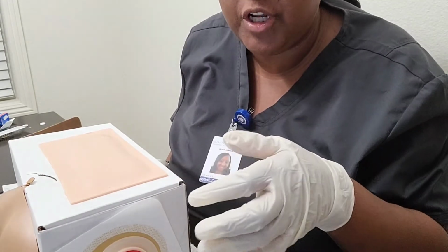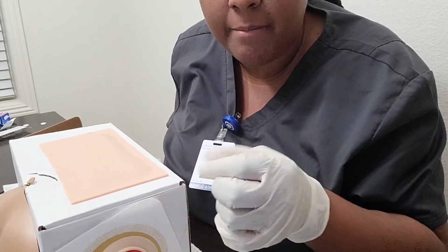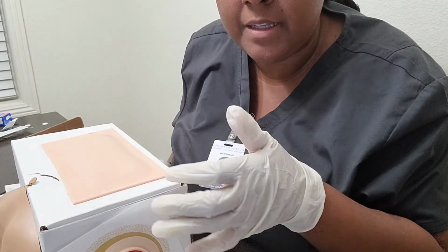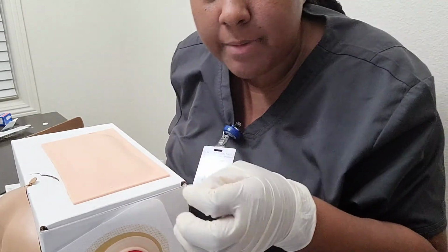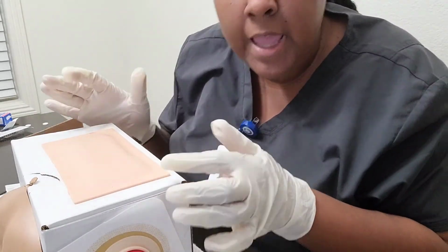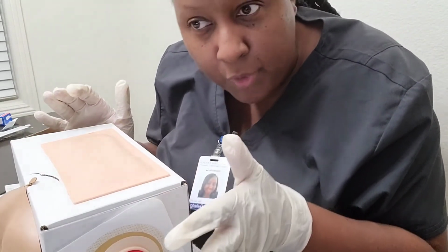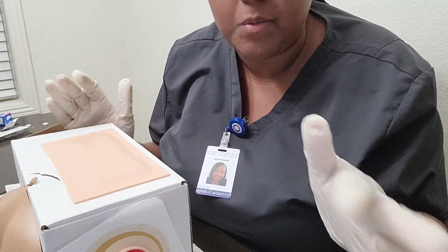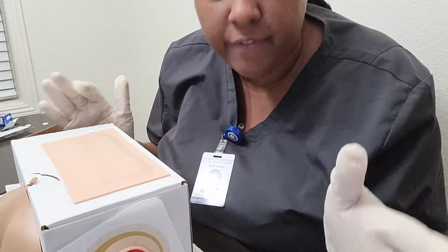And I would just like to note that I will measure the correct size by grasping the skin fold at the site with my thumb and forefinger, and measure the fold from top to bottom to make sure that the needle is 1/2 of the length of the fold.